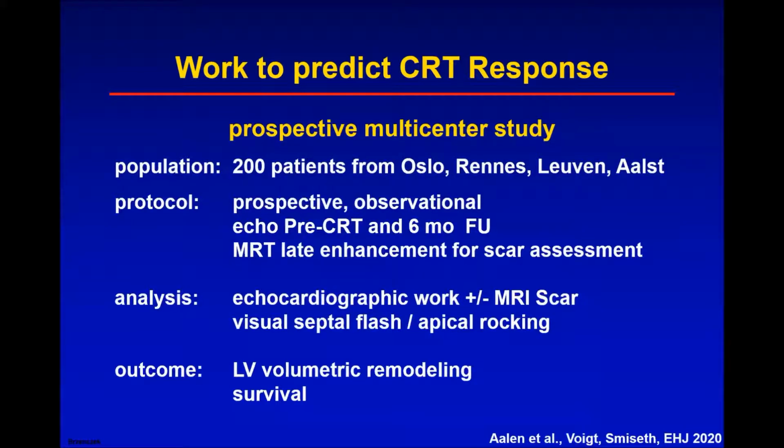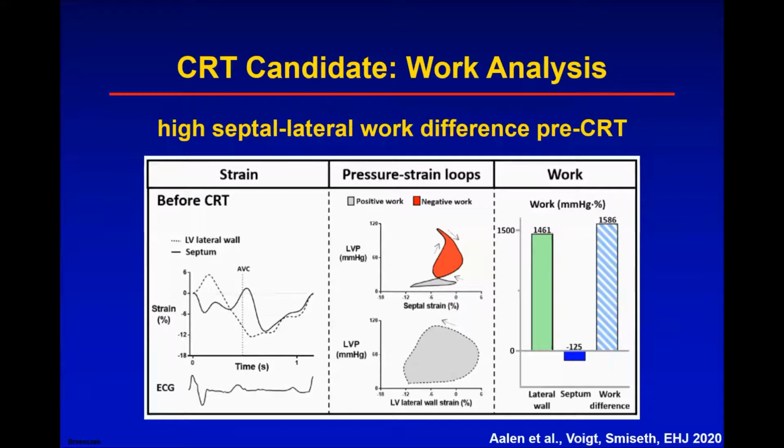We have tested that in a 200 patient study together with the colleagues from Oslo and Rennes and Aalst. And in that study, that was a prospective but observational study, we have looked into the echo pre-CRT and 6 months follow-up. We had scar definition by MRI, and we looked at the echocardiographic work before CRT implantation and the scar extent. And of course, we looked at septal flash and apical rocking. And then we looked into the outcome data of volumetric remodeling and survival of the patient.